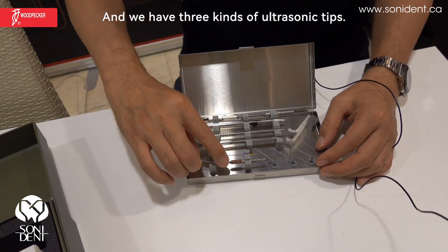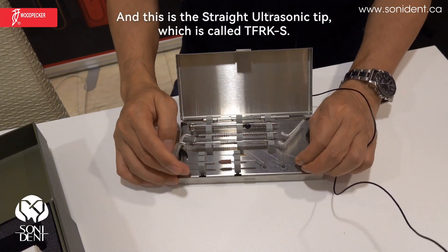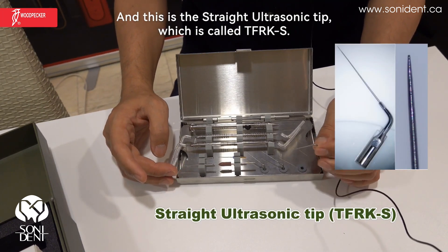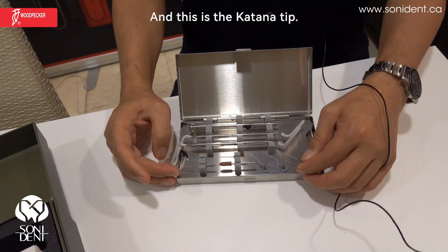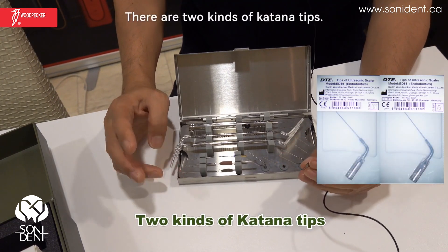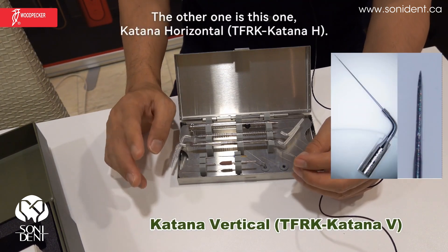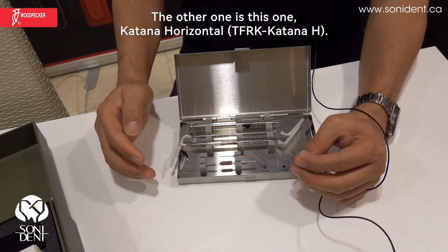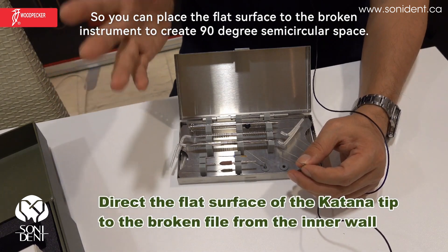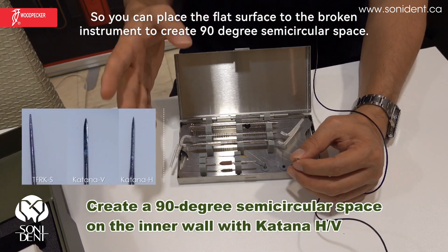And we have three kinds of ultrasonic tips. This is the straight ultrasonic tip, which is called TFRKS. And this is the katana tip — there are two kinds: one is katana vertical, and the other one is katana horizontal. You can face the flat surface to the broken instrument to create a 90-degree semi-circular space.